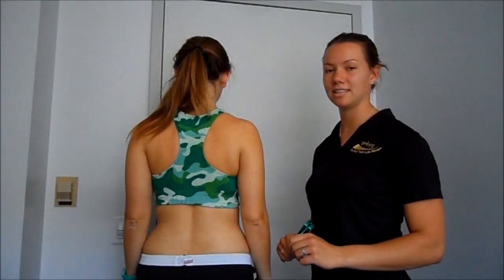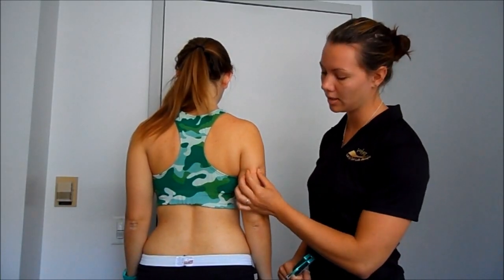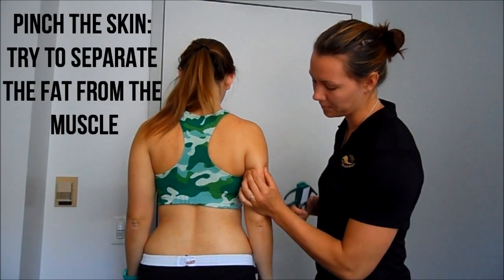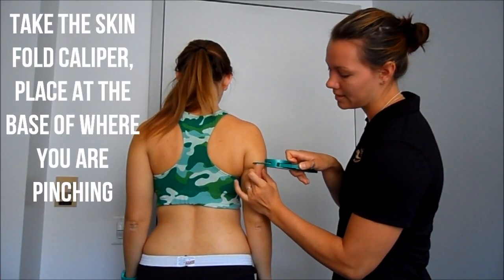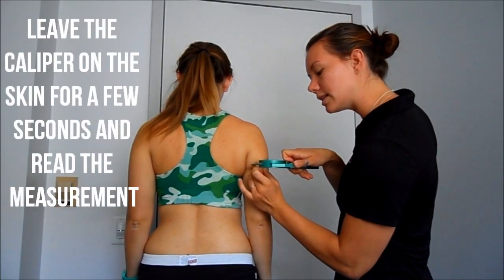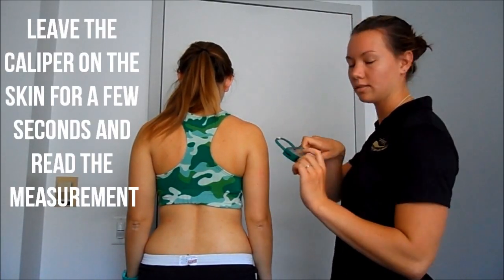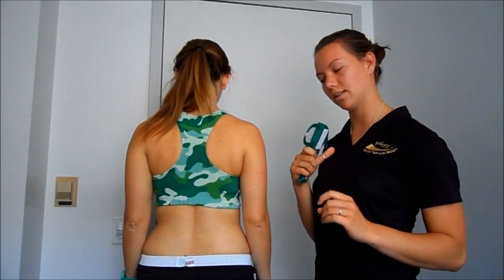Now for the actual testing, you want to make sure your client is relaxed. Wherever you made your marking, you're going to pull the skin out just a little, trying to separate the fat from the muscle. Take the skin caliper and place it at the base of what you've pulled out, let it sit for a second before you take your reading. Note the number on the dial, then press the button and take it away.